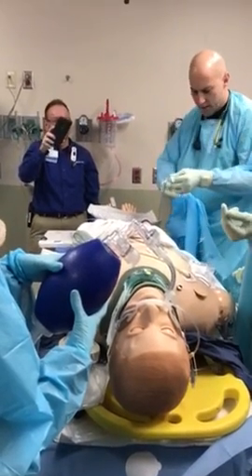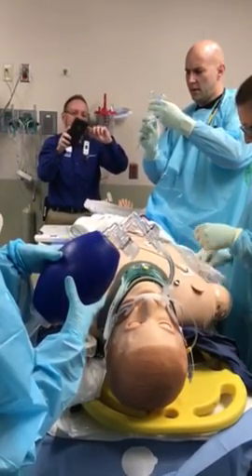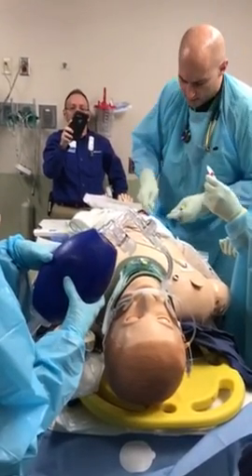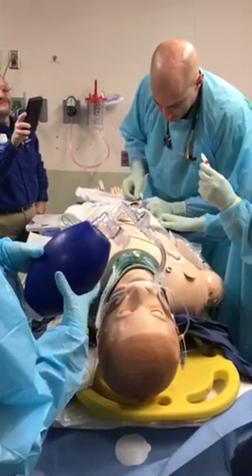Can I get that? We have 20 cc's. We have 15 in here — we're going to go for 10 cc's. We'll engage this and start to advance that catheter. About 10 cc's.